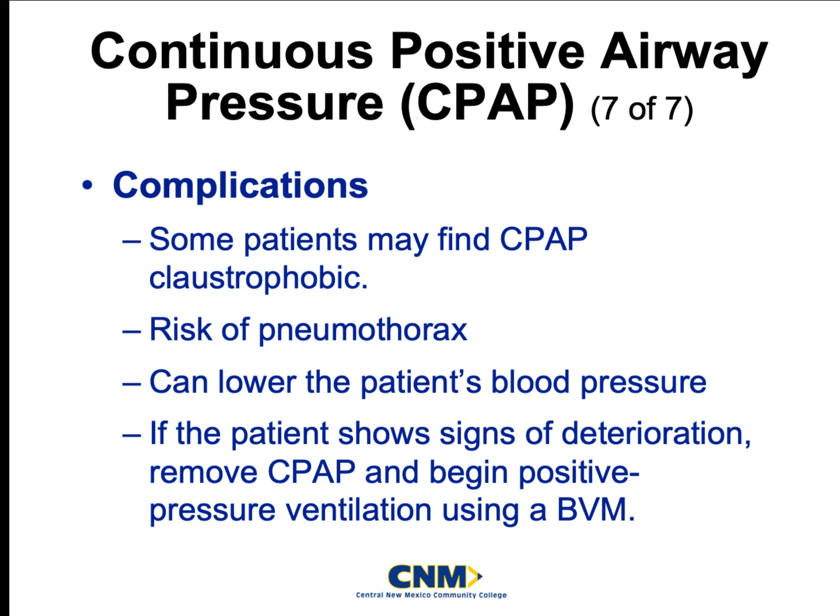If the patient does start showing signs of deterioration, if the patient's respiratory drive is starting to lower, if they look like they're getting more pale, if we're seeing drops in pulse ox, if we're seeing rises in end tidal, if they are just starting to get tired, more than likely we will have to remove this from them and start to bag our patients.